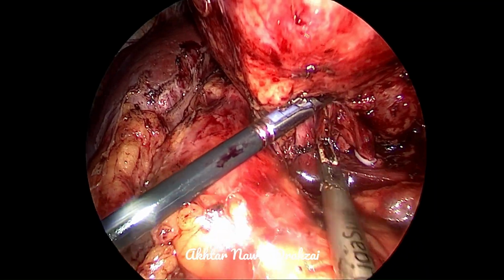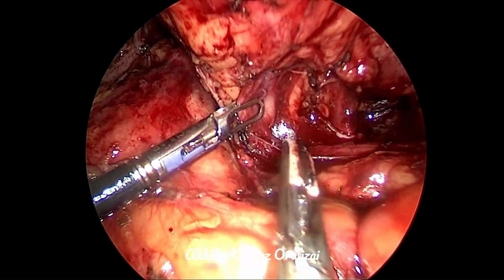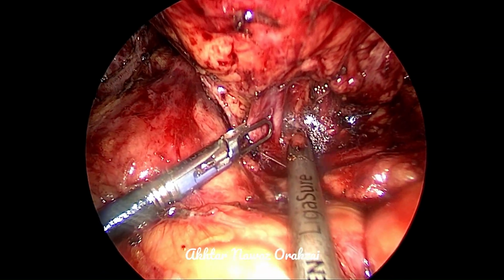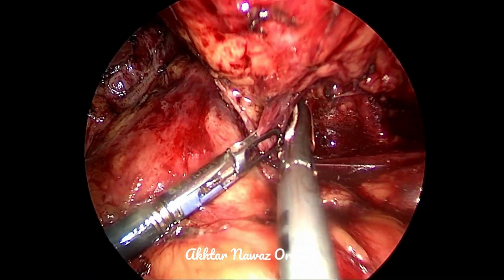Here you can see the horizontal gonadal vein. So we will be dissecting the renal vein lateral to this gonadal vein, and as close to the kidney as possible to avoid any injury to the structures which are located medial to this position.